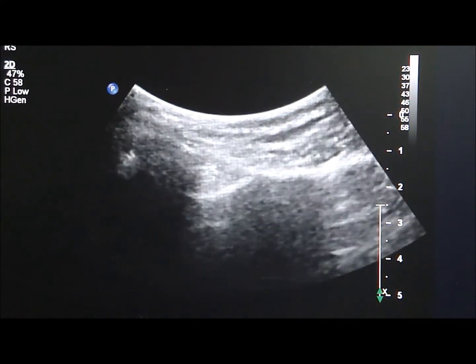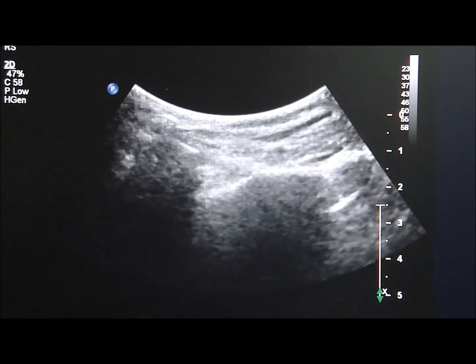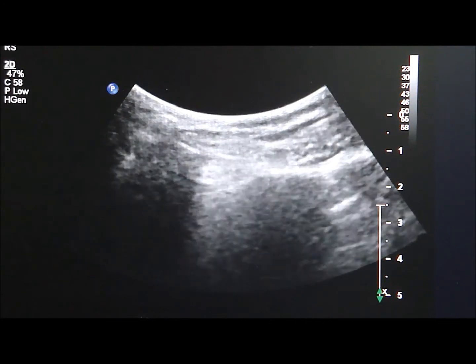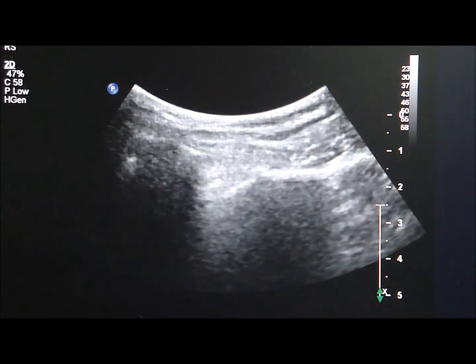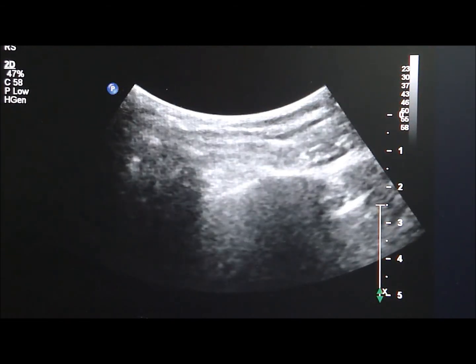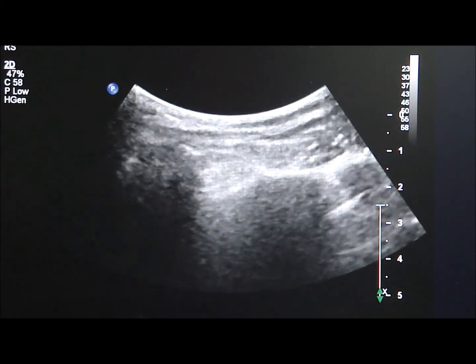As you can see here, the injection needle is approached from the medial to the lateral direction into the sacroiliac joint, and we will start the injection now. This completes our sacroiliac joint injection via ultrasound guidance to the left side.